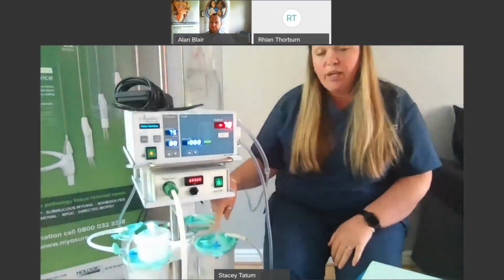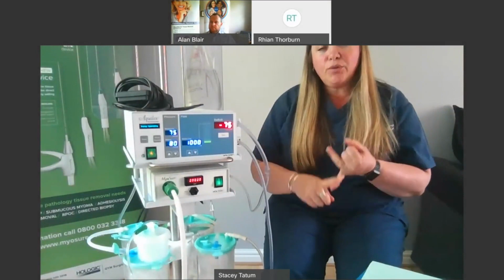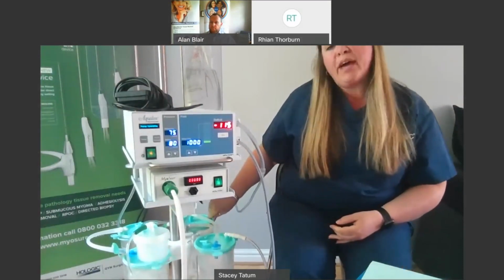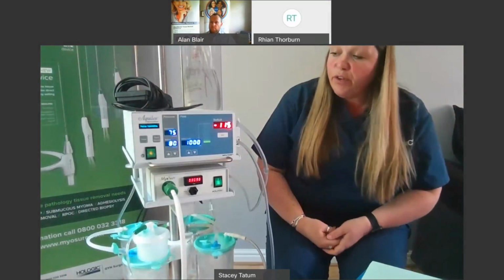So it is usually something to do with the canisters. So it's the first thing I would check. Make sure they're all sealed down tight. You may have changed them during the procedure. And make sure the back ones aren't filled either. It will stop sucking if your canisters are full.